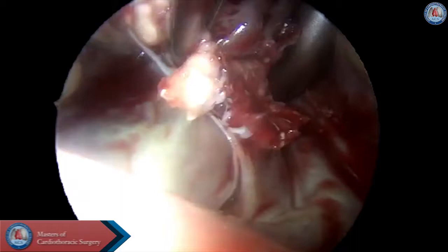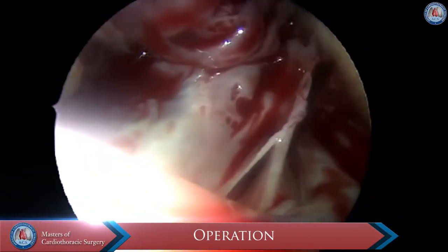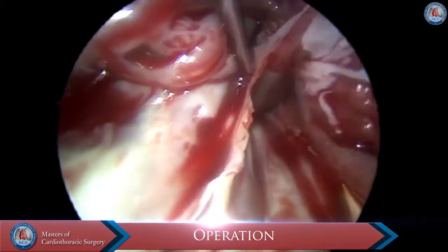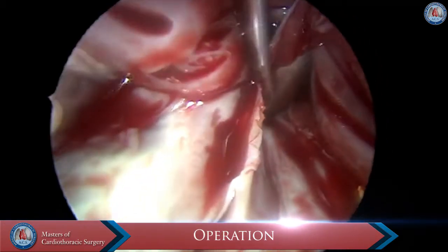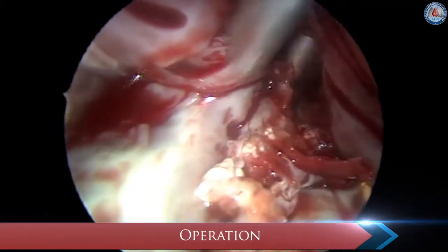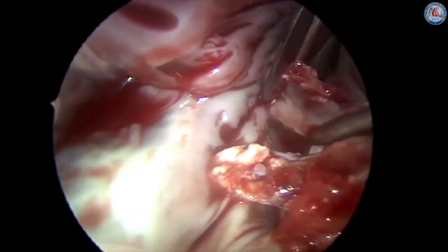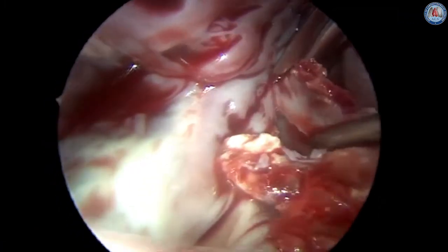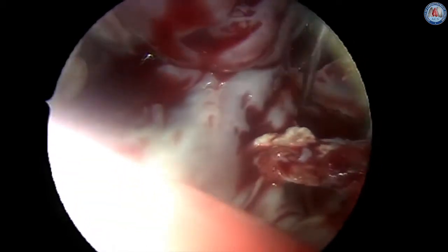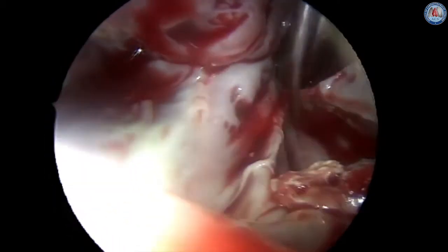After beginning of total cardiopulmonary bypass, right atriotomy is performed for inspection. A vegetation is observed attached to the eustachian valve of the inferior vena cava next to the venous cannulation site. We proceed to widely excise the vegetation and the infected tissue.